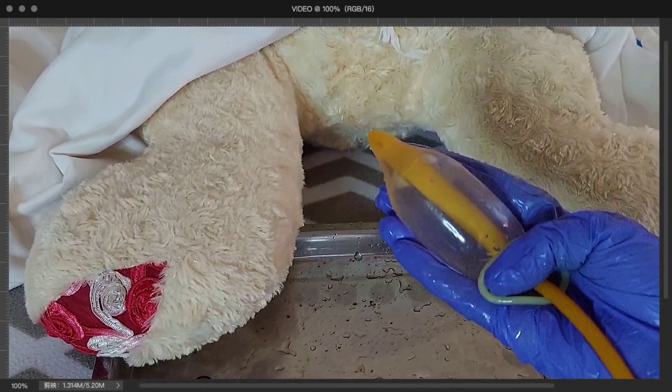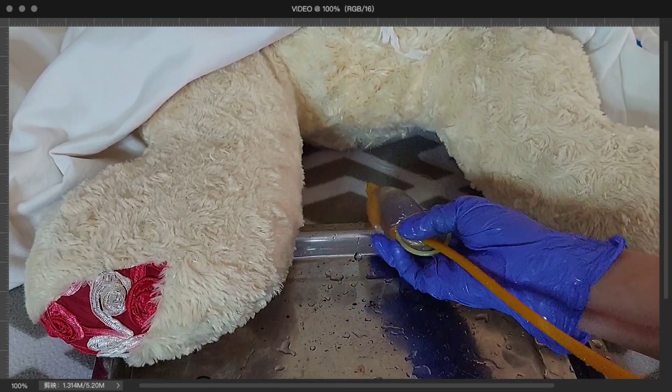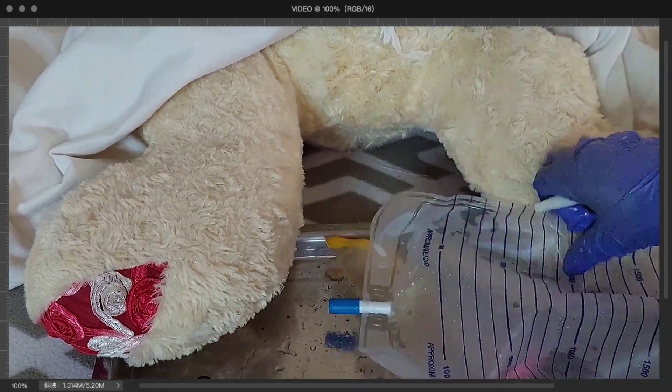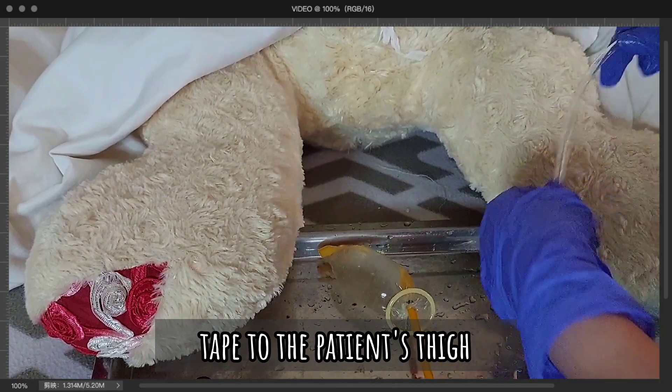Assuming that this is already at 500ml and it is already positioned at the cervix of the mother, I will now clamp it. Then, I will tape this to the thighs of the mother.